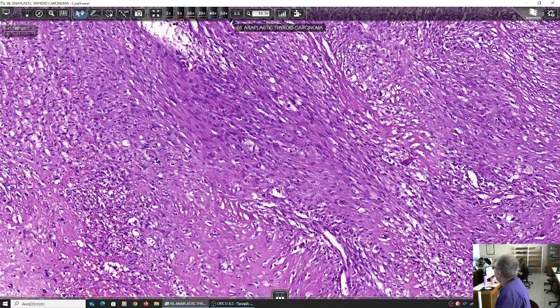Deriving from connective tissue. And how do we call malignant mesenchymal tumors? Tumors deriving from connective tissue, from muscle tissue, from neural tissue. How do we call them? Not carcinomas. No. This is benign. You have to tell me the malignant one. How do we call it?